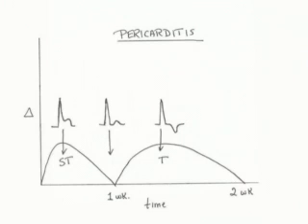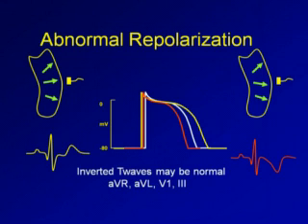After that, it's going to ruin the T wave. And it ruins the T wave in pretty much every lead. So you get very small, low amplitude T wave inversions in all of the leads where you had ST segment elevation, called a non-specific T wave abnormality. When we talk about ischemia, remember Q wave is infarct, ST segment is injury, T wave is ischemia.